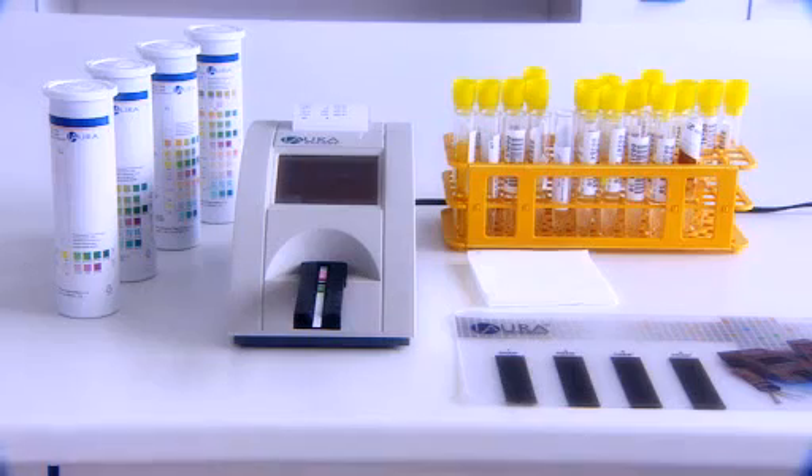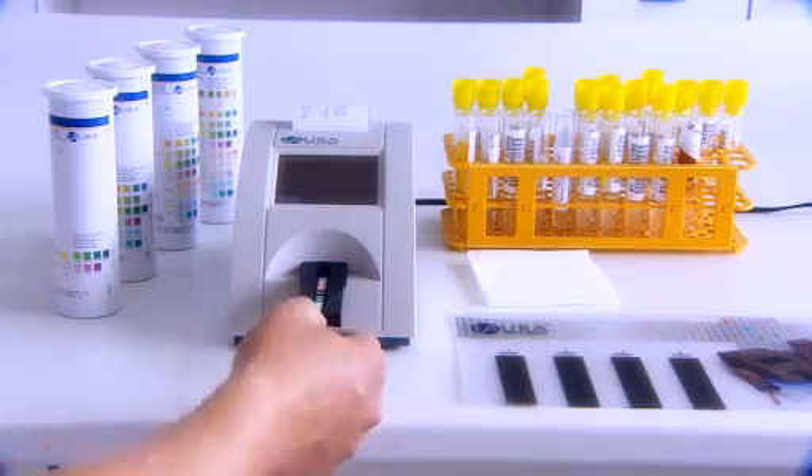The compact LoRa smart reader is an intelligent solution to urine analysis in the laboratory or clinic. It gives you objective, quick and effective processing of samples with high reliability.